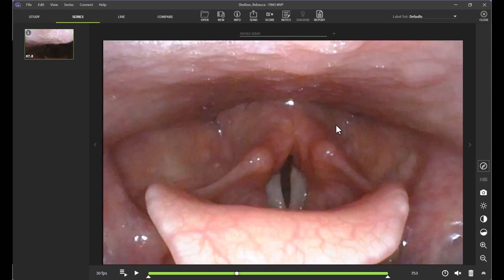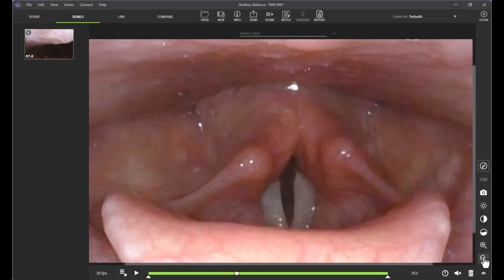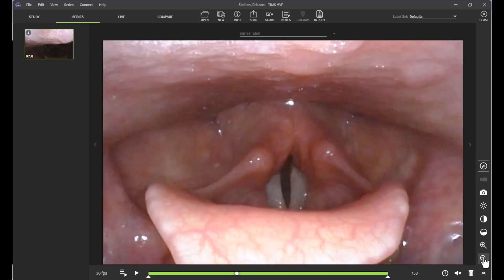In this video, we will be reviewing how to adjust aspects of image quality in the TIMSS MVP software. As you can see, I have a fee study pulled up on my TIMSS workstation. I can zoom in and zoom out utilizing the magnifying glass found here on the right hand side of the screen.